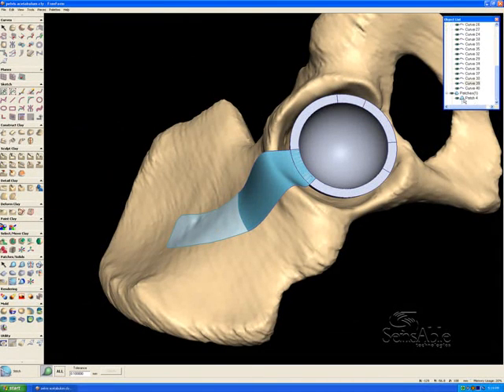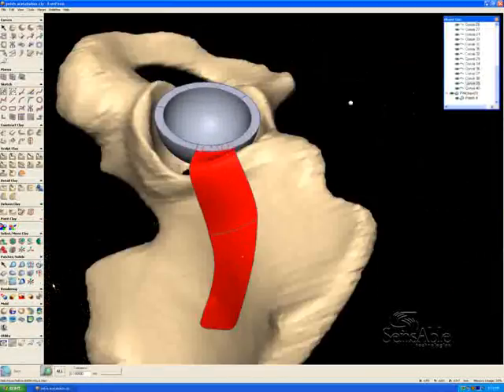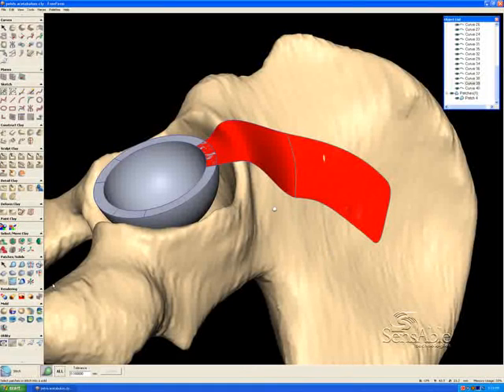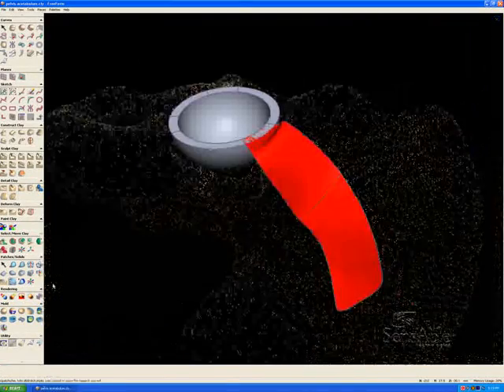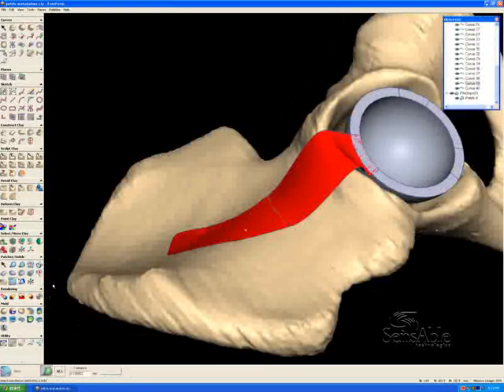So now we have three surfaces that are stuck together. Only one of them is fit to the clay, and it's represented here in the object list. In my patch display properties, I'm going to turn on something called Shade with Backface Color. You can see that what that does is it shows me the direction in which this surface normal is pointing. That's important to us here because we want to thicken this collection of surfaces to a distance of a few millimeters that will represent the thickness of the tab. Red is the direction they'll thicken to, so everything's fine.